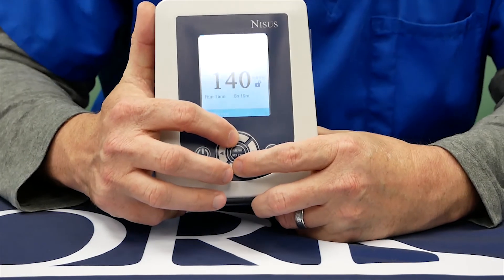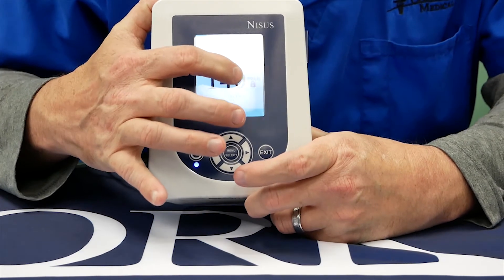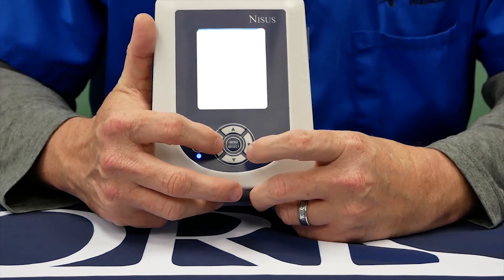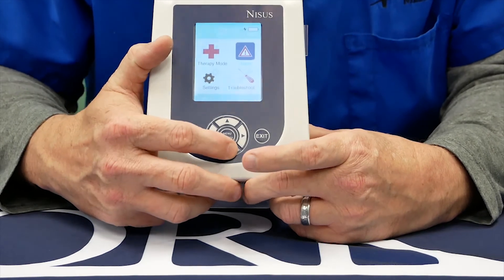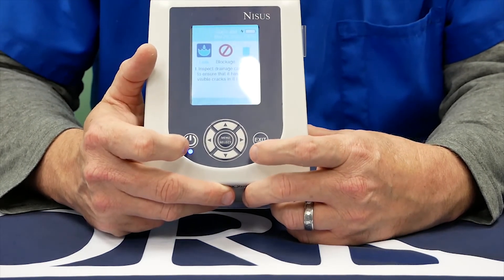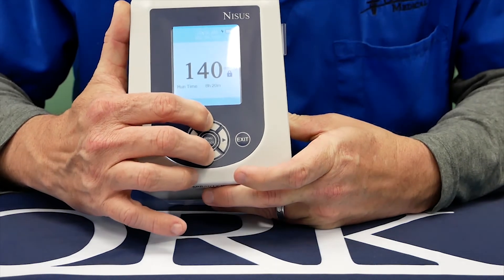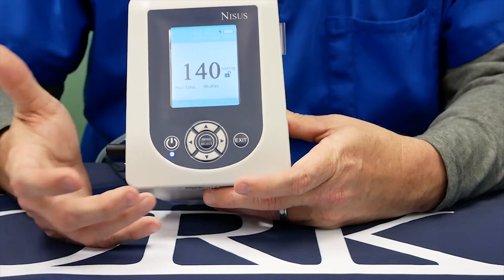If you need to lock the device, you can press the up and down buttons together and you'll see the icon turn to a lock icon. During this, you can hit the menu, but it will not allow you access to any of the menus — although the patient can still read about troubleshooting, which is the fourth icon. To unlock the device, press up and down arrows together and you'll see the lock become unlocked.